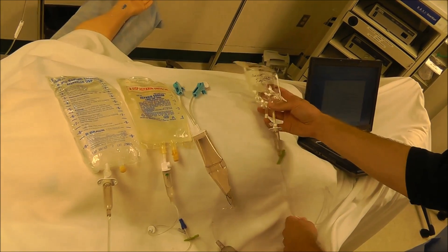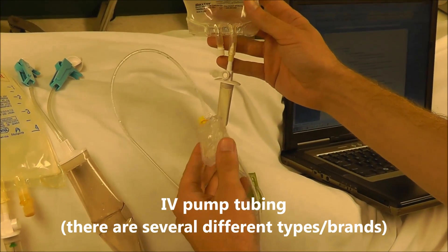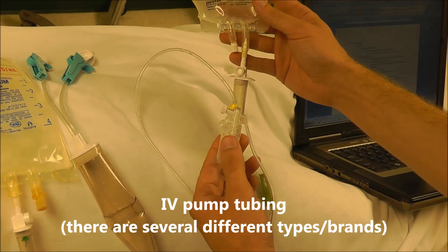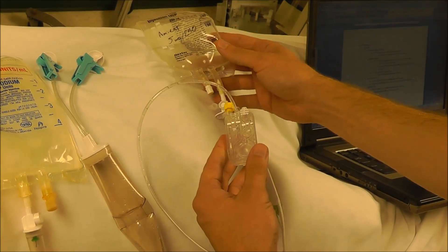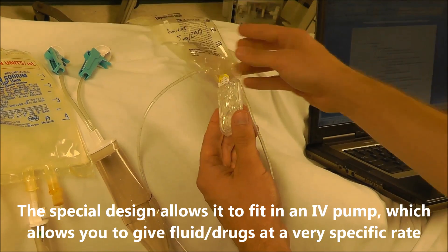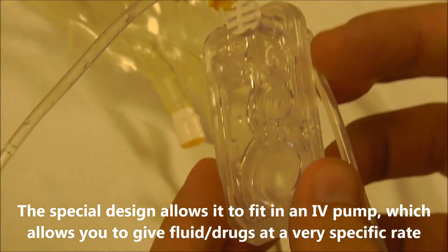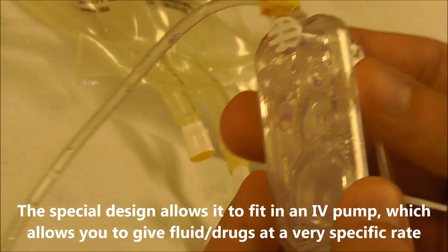The next type of tubing is specialized tubing that fits into an IV pump — this is called IV pump tubing. You use this if you want to run a piggyback infusion at a very specific rate. It has a distinctive design that allows it to fit into an IV pump.